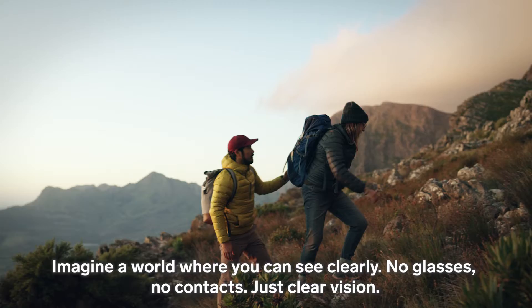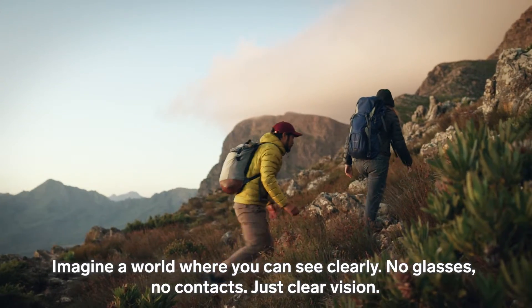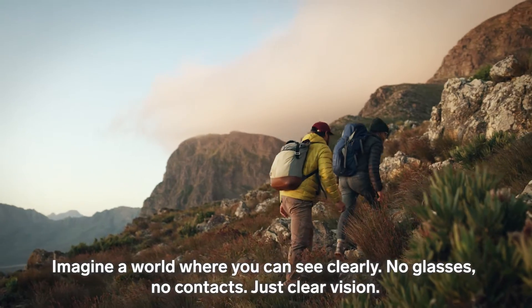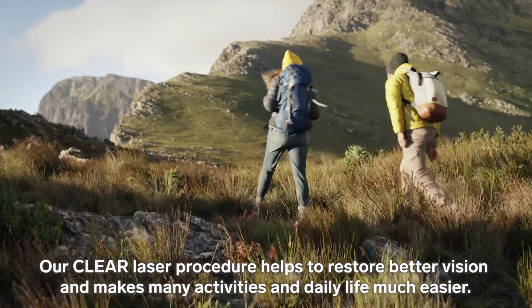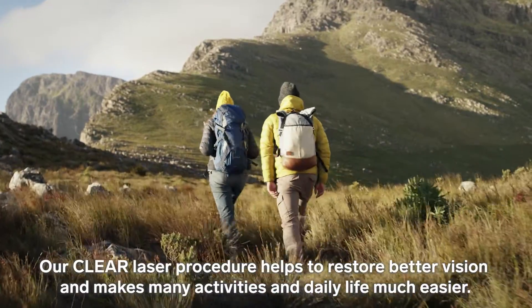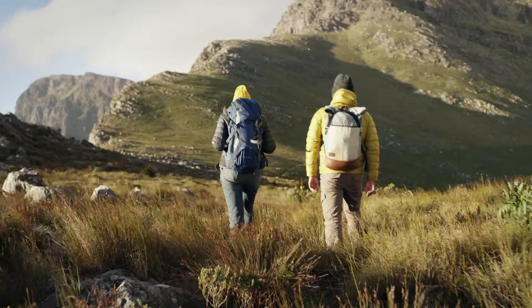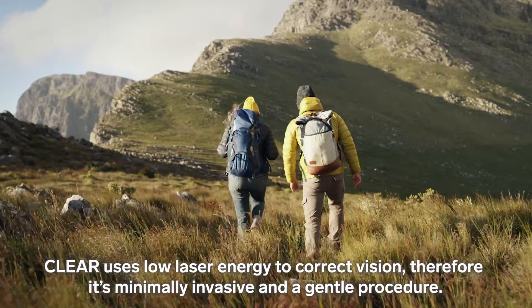Imagine a world where you can see clearly — no glasses, no contacts, just clear vision. Our CLEAR laser procedure helps to restore better vision and makes many activities and daily life much easier.